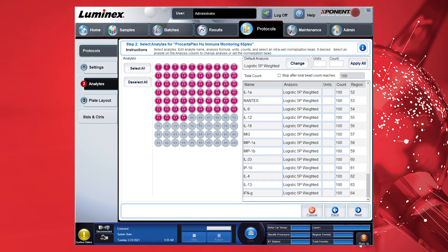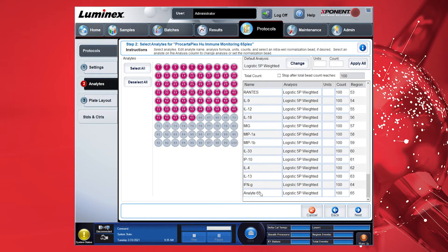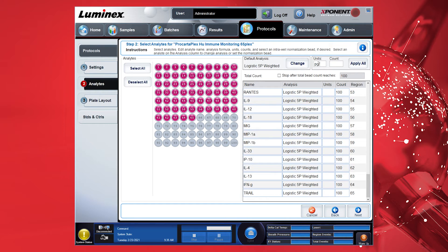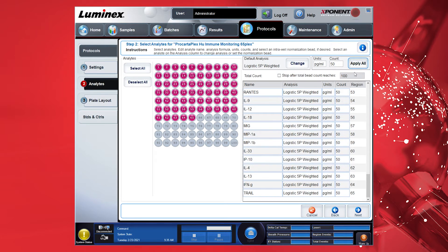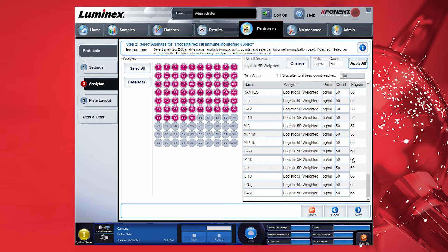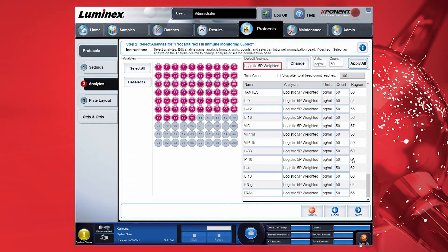Enter the unit from the Certificate of Analysis, for example, picograms per milliliter. Set the required count to 50 beads per analyte and do not select the option for total count. Then select Apply All and it will automatically update all targets. In this same table, you can choose to change the analysis setting. We recommend leaving it at the default setting of Logistic 5PL Weighted. Then click Next to proceed.